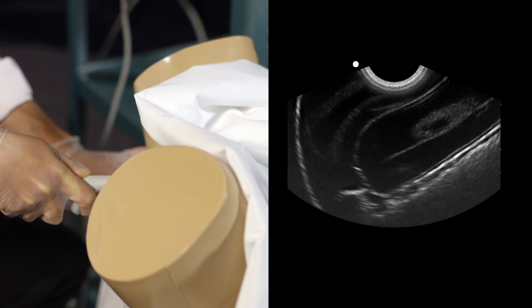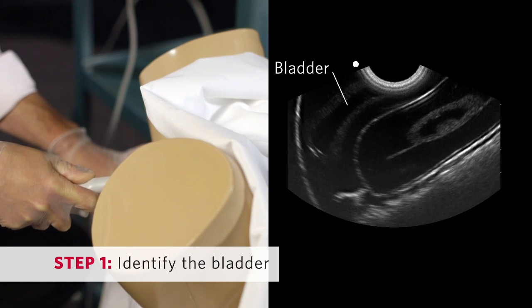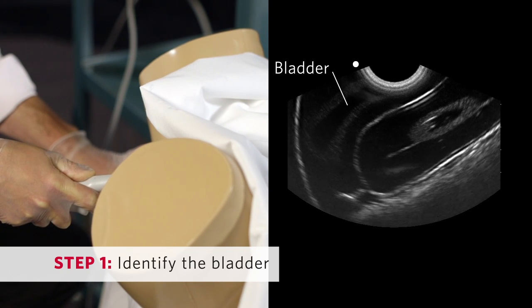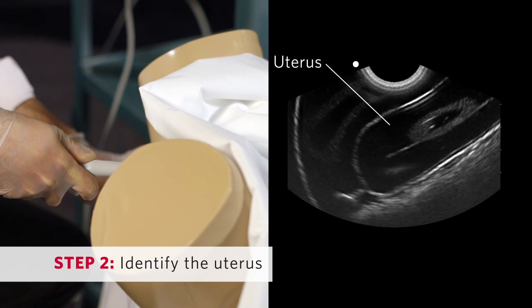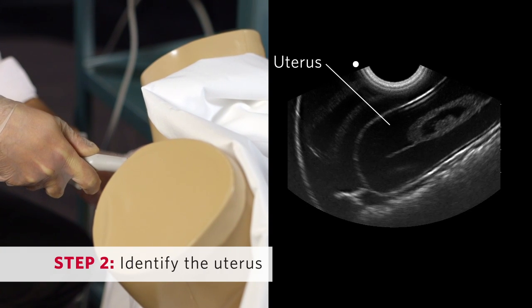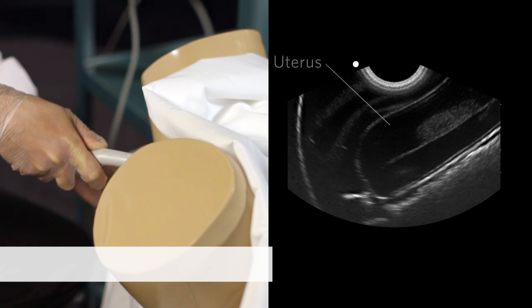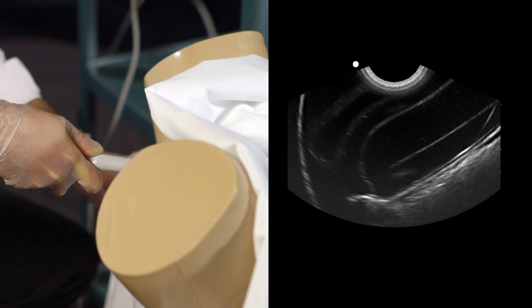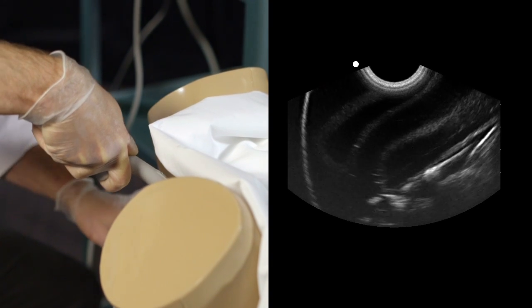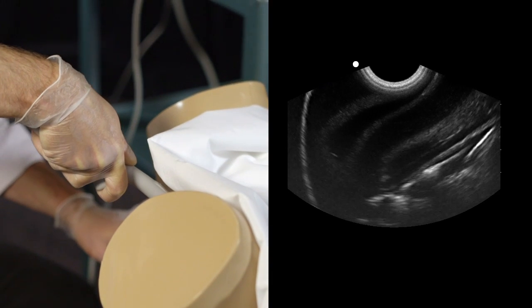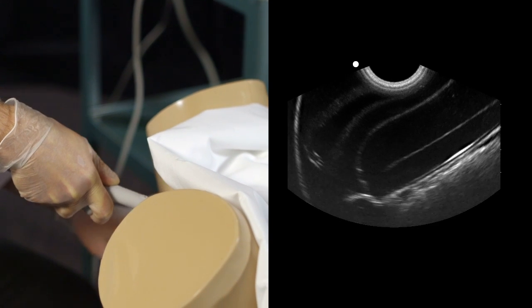Push the probe handle towards the floor to identify the bladder. In the sagittal view, the bladder is visualized in the near field to the left of the screen. Next, identify the uterus, which is always next to the bladder. If finding the uterus is challenging, perform a large sweep. A retroflexed uterus may require you to lift the probe handle towards the ceiling, aiming the probe towards the coccyx. An antiflexed uterus may require the opposite — push the handle down to raise the probe up.